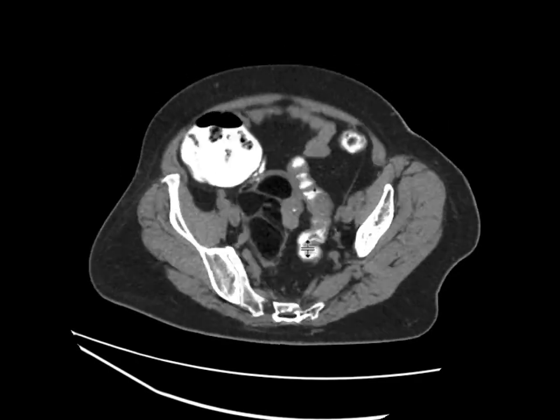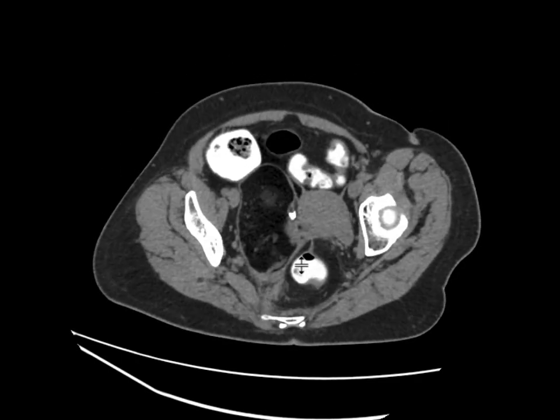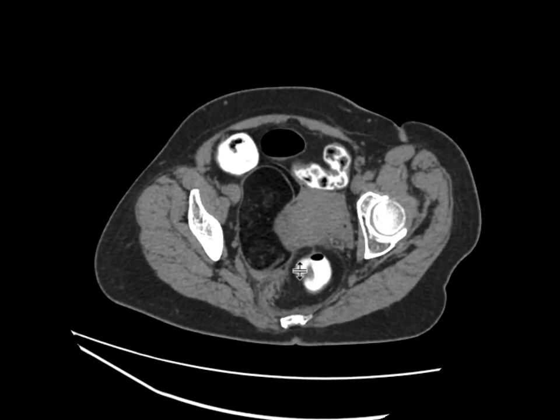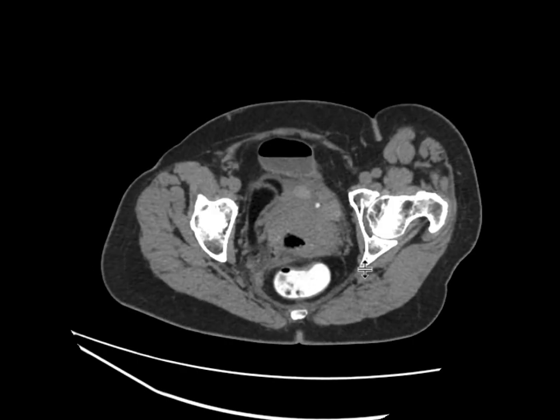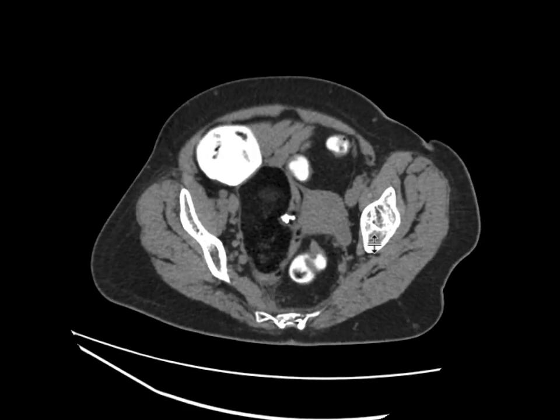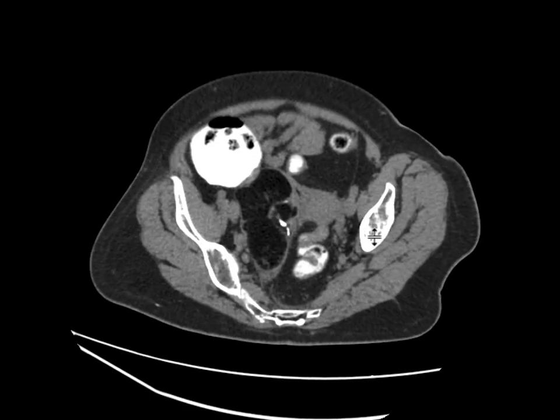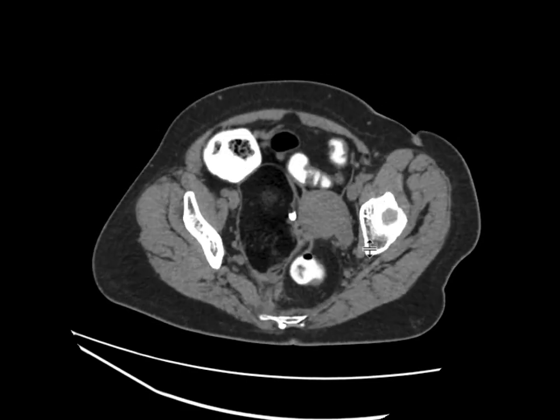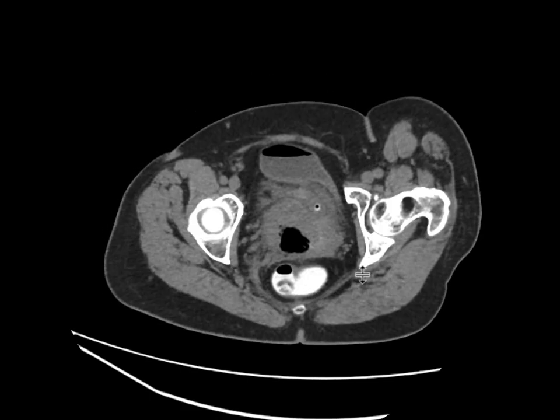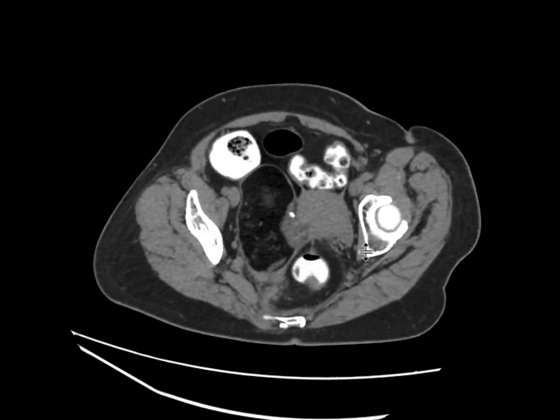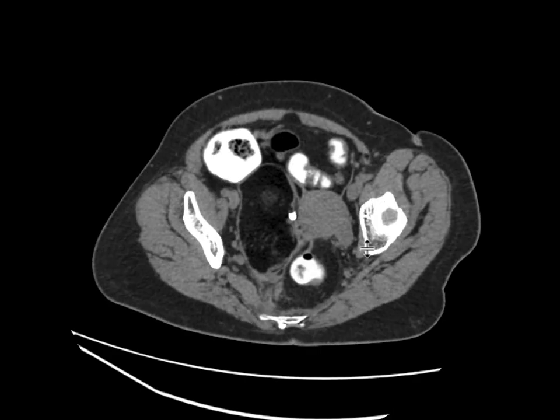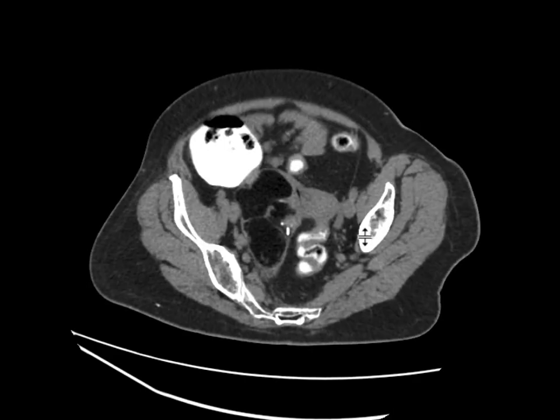If we look at it, we notice that the outer wall is a little bit thick, and if we look at the surrounding soft tissues, there's a little bit of stranding, maybe a little bit of fluid associated with it. That raises the suspicion that maybe this is undergoing a little bit of torsion, maybe even rupture.